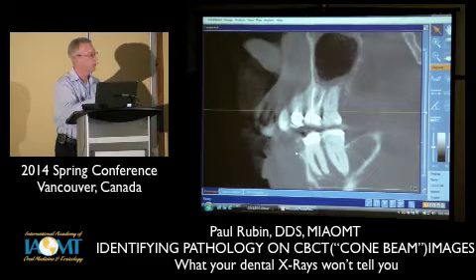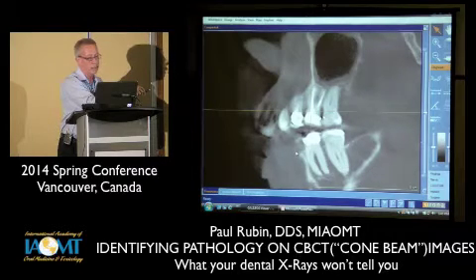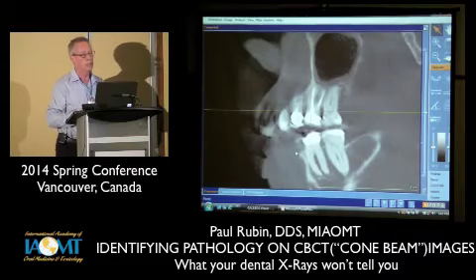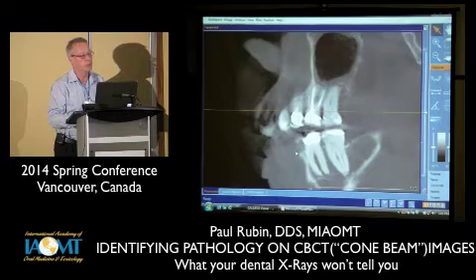Here's that root canal. One thing that I am noticing here, and you would have seen it on the radiology view also, the lining of her left maxillary sinus is thickened. I'll have to show you what a normal one looks like, but this area right here shouldn't be there. It should be just a thin plate of bone, but you're seeing a thickened membrane in the sinus, which is indicating inflammation or infection there.